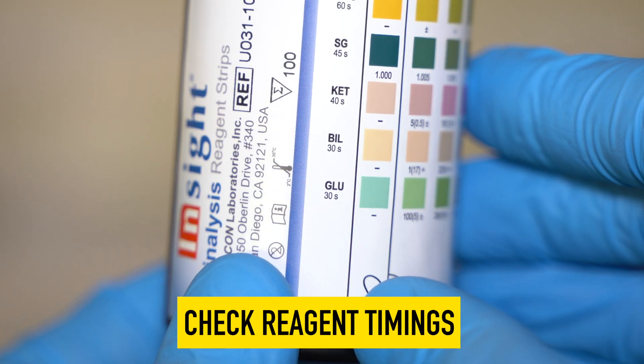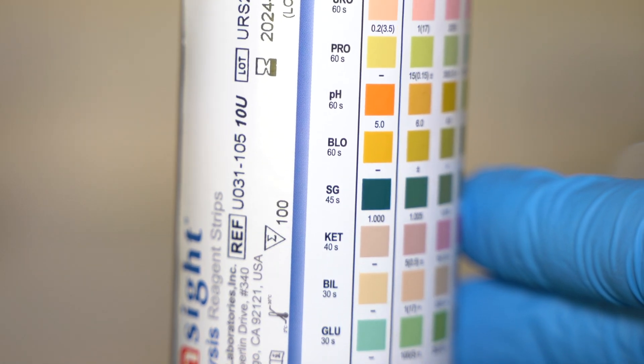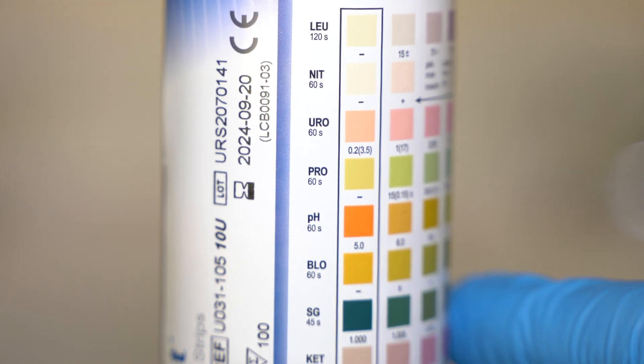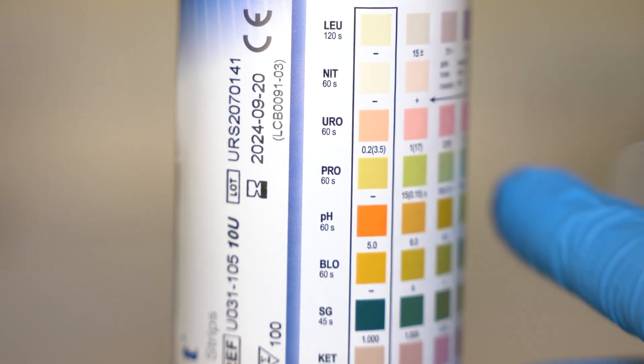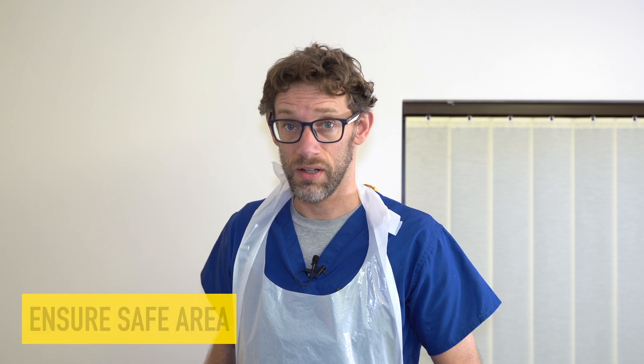For example, to check for glucose in the urine, it will take the reagent 30 seconds to give us a test result. Conversely, the leukocyte test will take 120 seconds before we can accurately read the result. So make sure you know the different times on the sticks that you're using, because they may differ between brands. Make sure you're using the appropriate area — a clinical sink where you're not going to be putting anybody at risk.